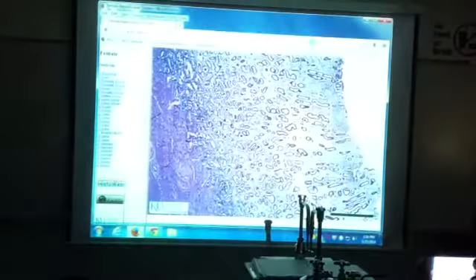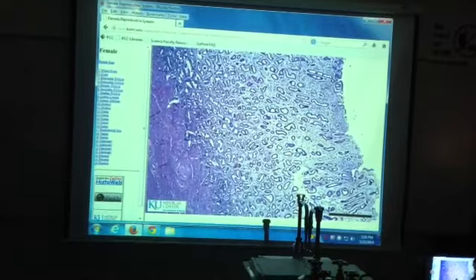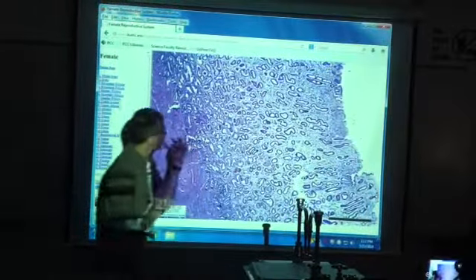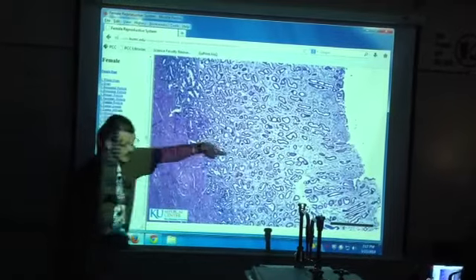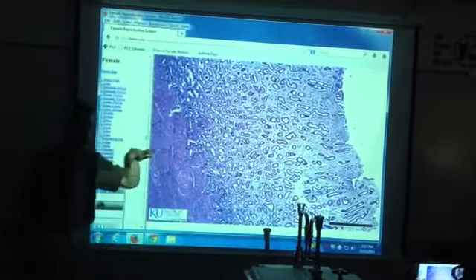They look like they're long and straight and not too bad. Okay, compare what you saw in your head to this picture. Tell me about the glands. They're squiggly. There's more of them. What else do you notice about their shapes? They're convoluted, like that word. They're bent, corkscrew. Very few of them are straight around.